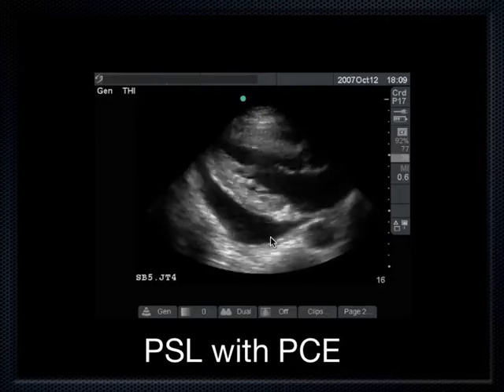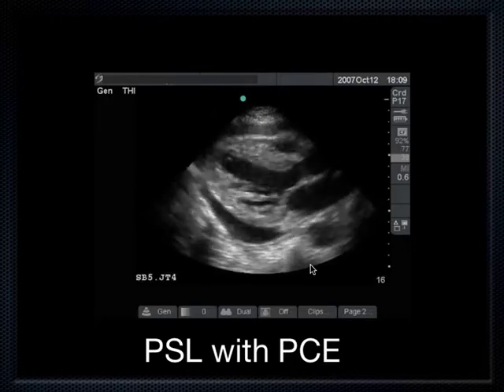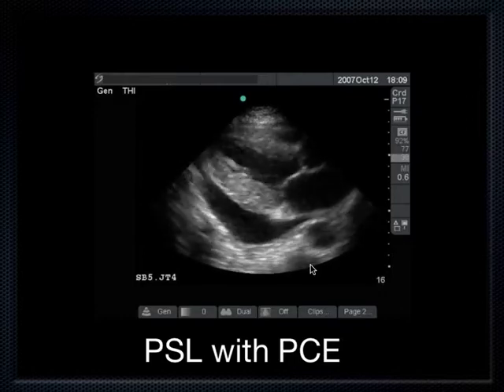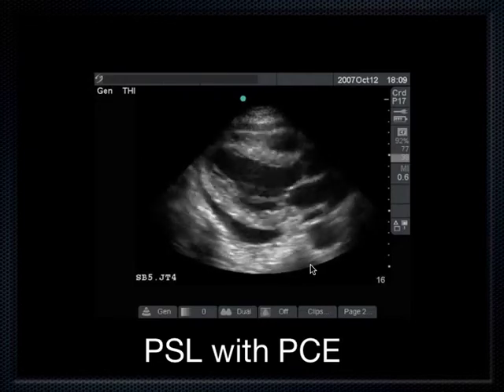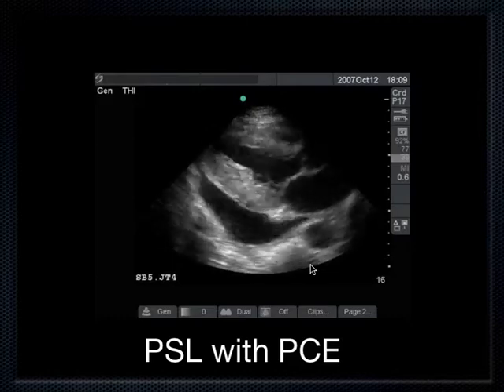If this effusion was to walk down behind the thoracic aorta, then it would be pleural. Yet another reason why I like that subxiphoid view to confirm a pericardial effusion, because I don't get into any confusion with the chest then. I just see liver, RV, LV in the subxiphoid view, and the pericardial effusion is seen nicely above the RV.